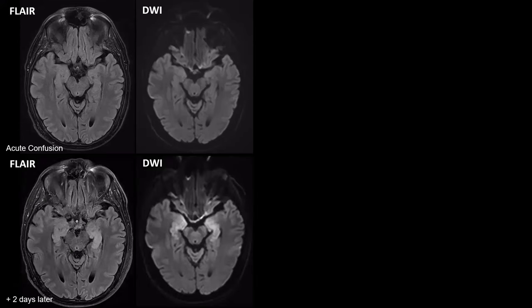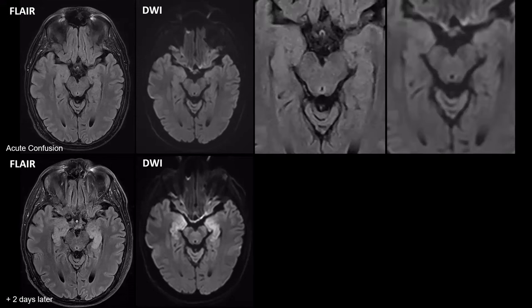The patient received another MRI two days later because the confusion just got worse and the patient also suffered a first-time seizure. On the FLAIR images, we now see that both hippocampi as well as the uncus are swollen and hyperintense, also associated with a high signal on diffusion-weighted images. This was diffusion restriction — dark on the ADC map.